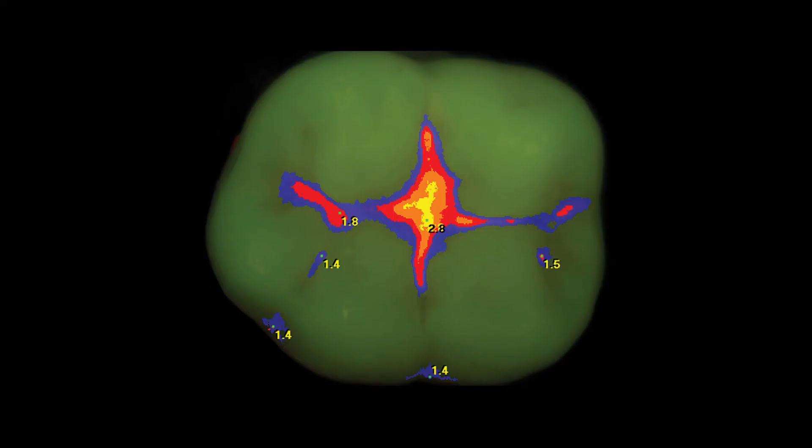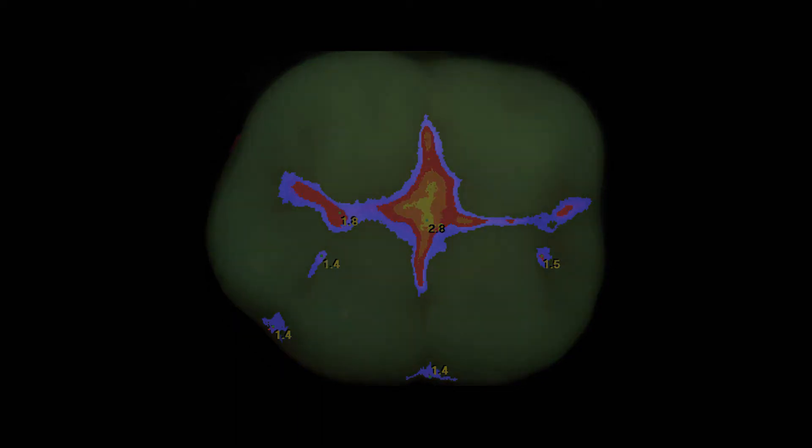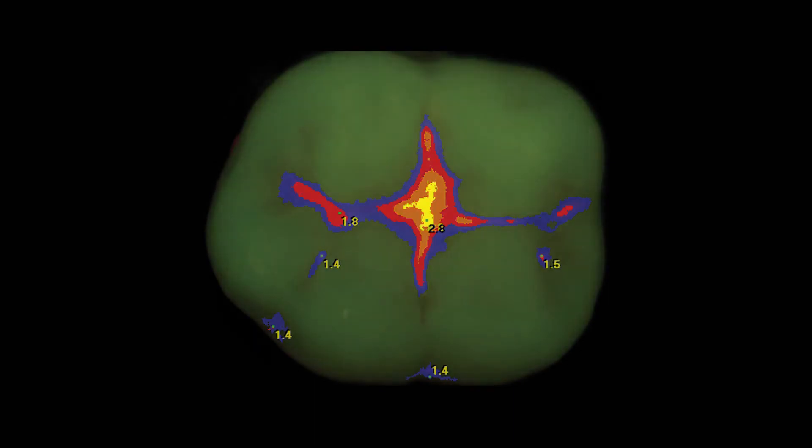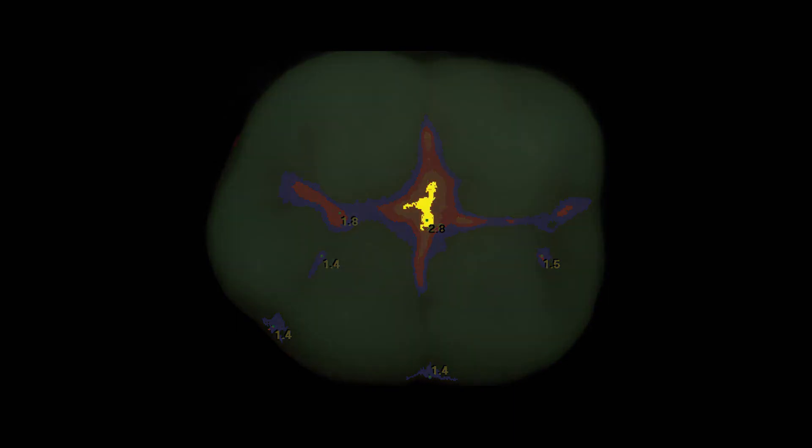Once the images are saved, the software algorithm will analyze them and give you a Doppler radar-like image, indicating any decay and its severity. Under Spectra's fluorescence visualization, healthy enamel fluoresces green. Blue indicates the beginning of enamel caries. Red indicates deep enamel caries. Orange indicates dentin caries. And yellow indicates deep dentin caries.